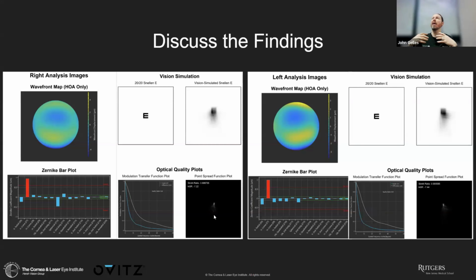What this does is it really helps you connect with the patient. If you look at the National Keratoconus Foundation's data that they recently showed, these patients have seen four other practitioners before they saw you. And trying to describe this to other practitioners who don't get it, if you can show them a simulation and say, hey, I totally understand what you're talking about, this is actually a simulation of how you see, they'll go, oh, wow, you get it.